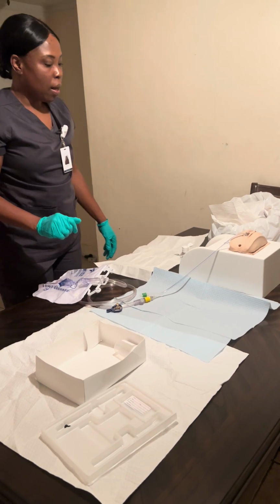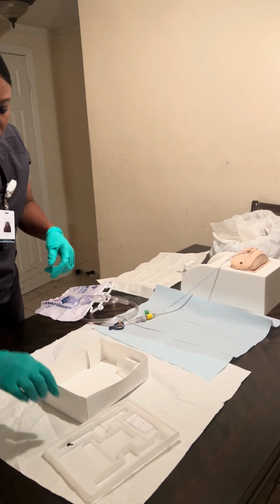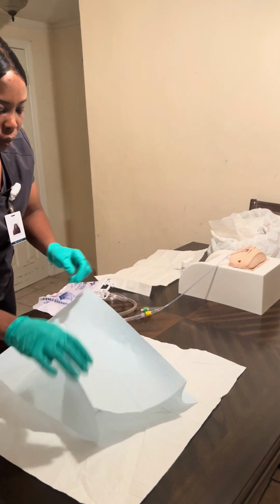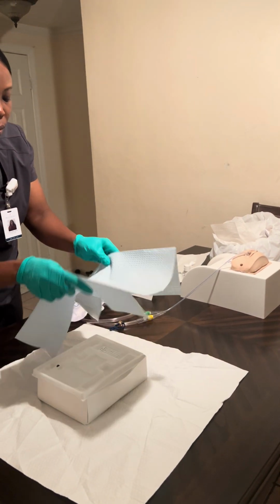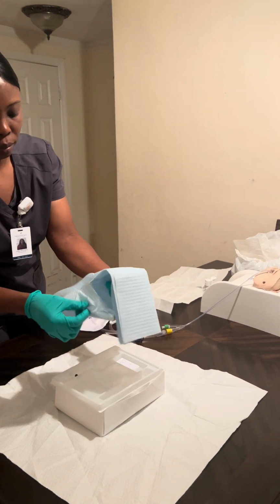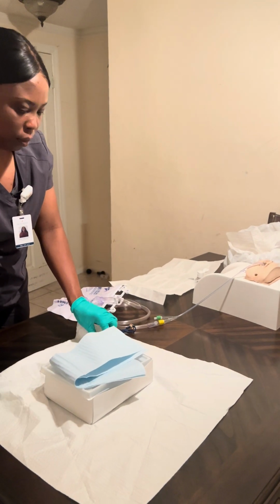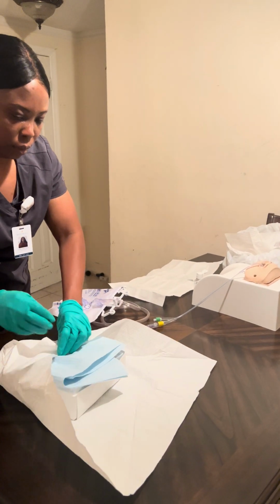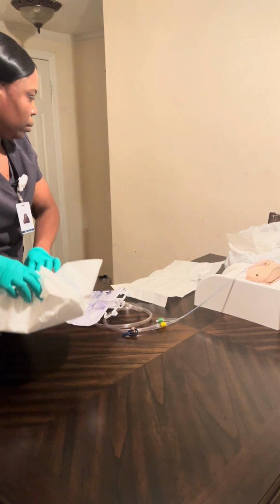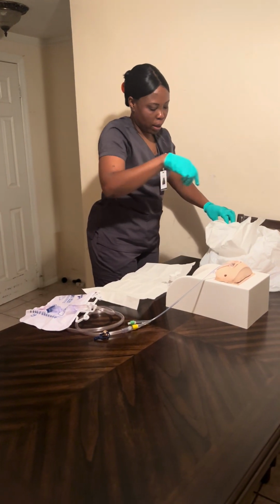Okay, Mrs. Smith, now I'm gonna clean everything, okay? I put everything in the garbage. Make sure not to touch it.